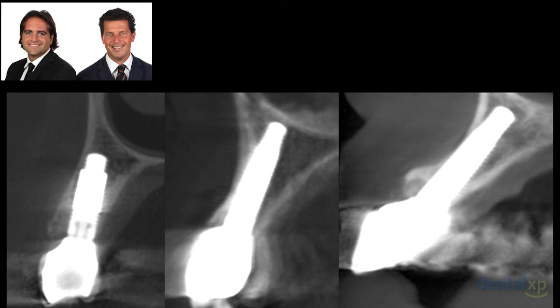And you can see this, that Joseph Kahn said this morning is the most critical area when we are planning and working in the esthetic area. We managed to have the correct volume of hard and soft tissue.